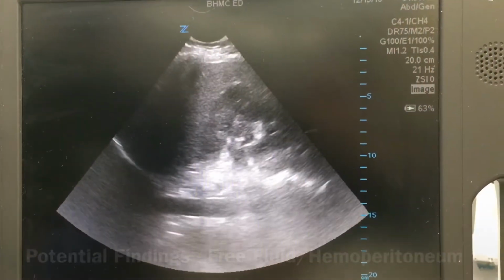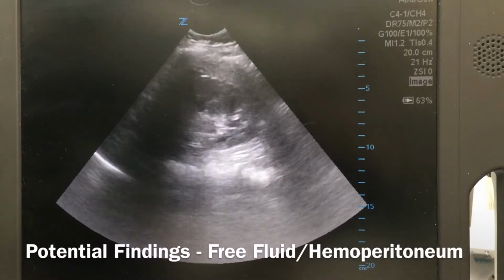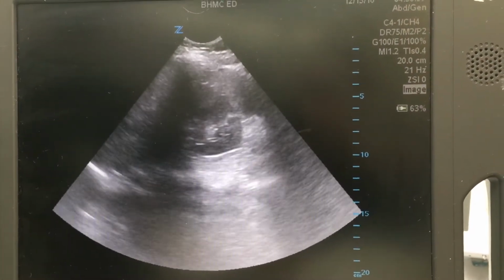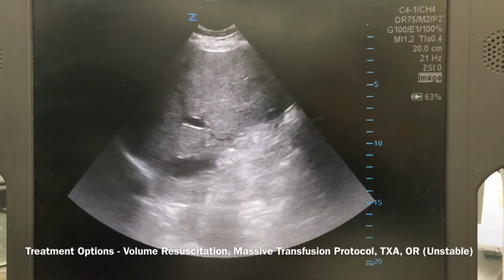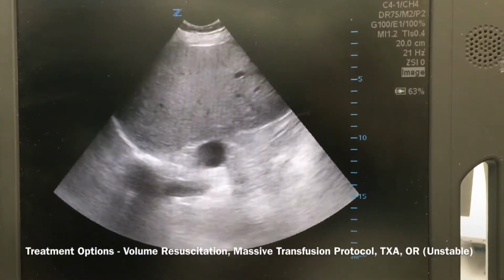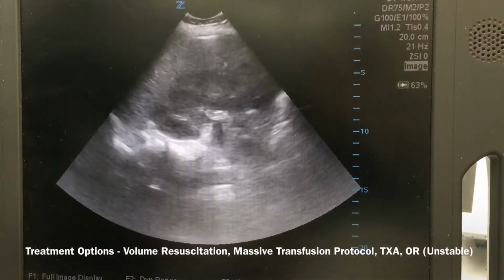We'll look for fluid between the liver and the kidney interface, and again, you want to make sure that you get the inferior pole of the kidney and also the liver tip. Like we said, the liver tip is the most sensitive area for free fluid in the abdomen. Also, if you're having some trouble with the rib shadows, you can always tilt the probe about 30 degrees in line with the ribs, and it gets rid of a lot of the shadows, and then you can scan through. In this case, it's normal.